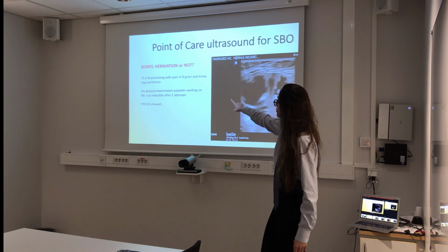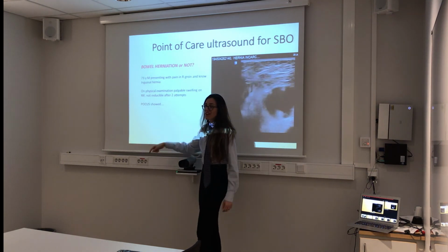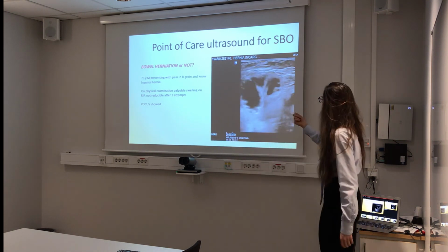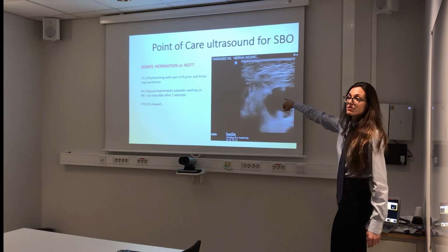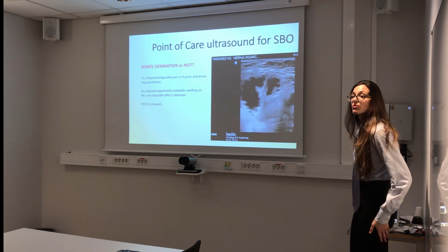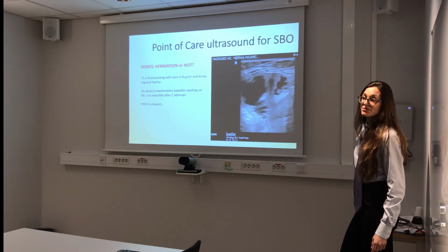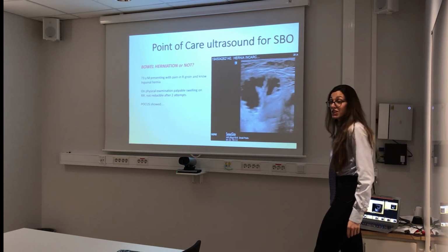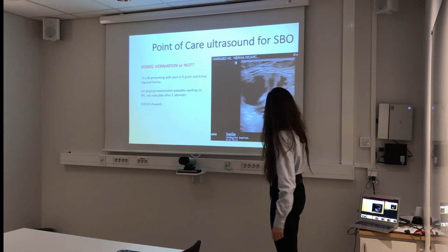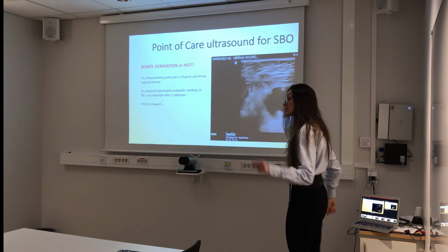Physical examination, palpable swelling, and if you see this, it's the same as the other one, so there is no big difference on clinical examination. And then I couldn't hear anything, but this is bowel. Looks like the bowel might already be necrotic in the hernia. Suggestion: put the Doppler on every time, especially at the neck of the hernia, because it's very suggestive.